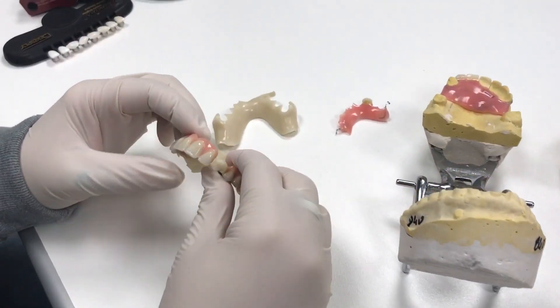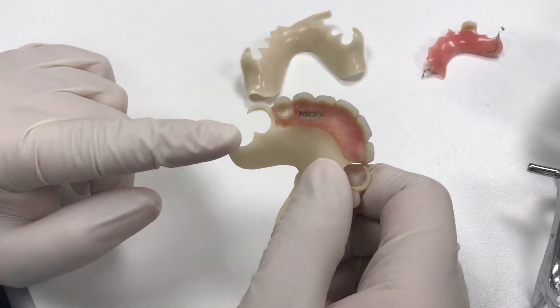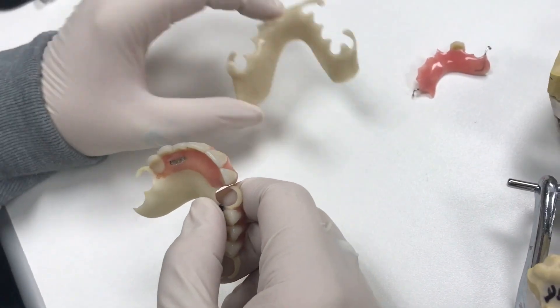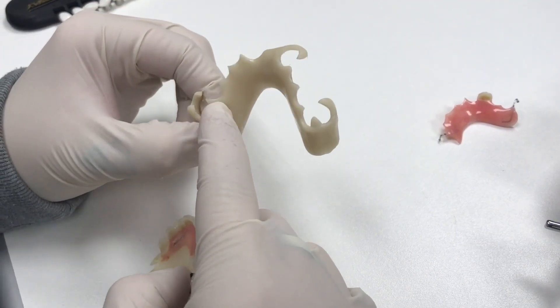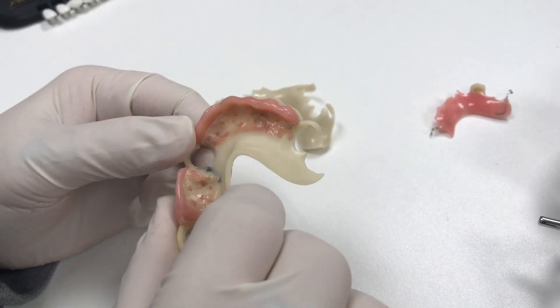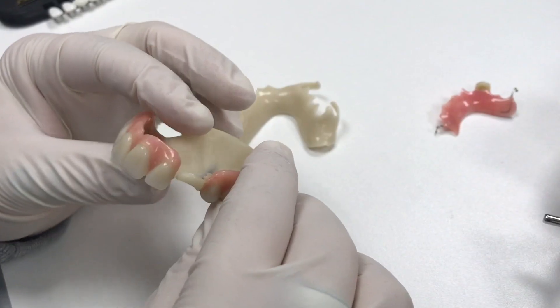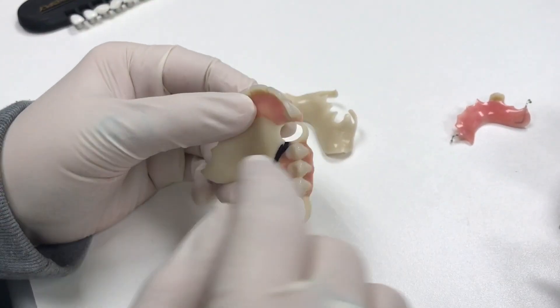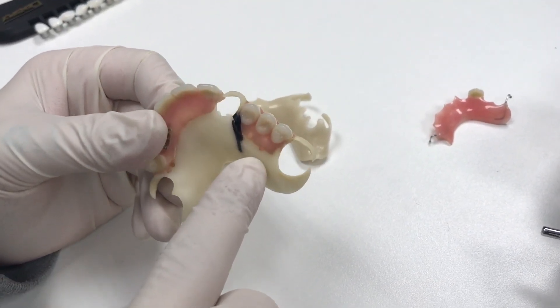Here we have a Duracetal partial, which is a tooth-colored material. It is all injected in one piece — the clasp and the framework. We'll inject the clasp and framework and it'll come out like this. Then we'll cut our retention holes in it, set some teeth, and send them out in a wax try-in if they want one, or we can go right to process. We process the teeth in just regular hard acrylic. It is an acrylic-based material, so they bond very well together, but we still do the mechanical retention just in case.